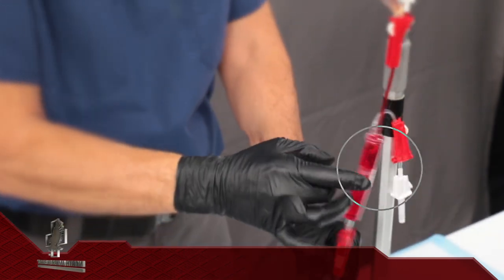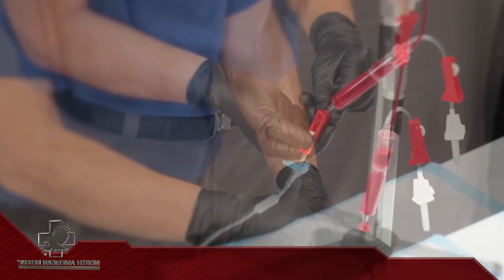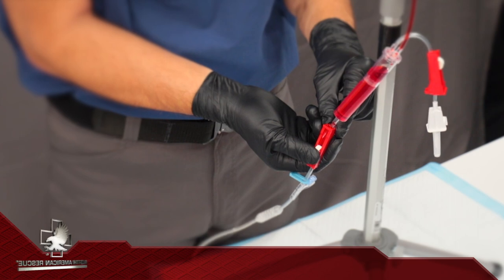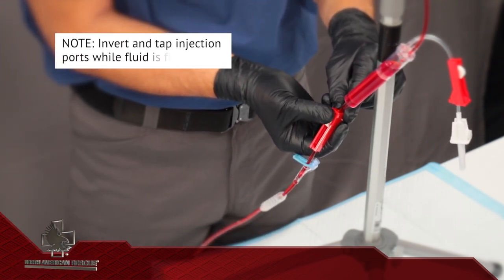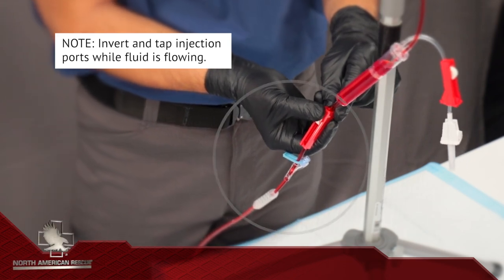Return the drip chamber to its upright position and tap a couple of times to dislodge any air trapped in the filter. Open the downstream clamp. Prime all the way until no visible air is in the tubing. Tap the injection ports when priming to remove trapped air.